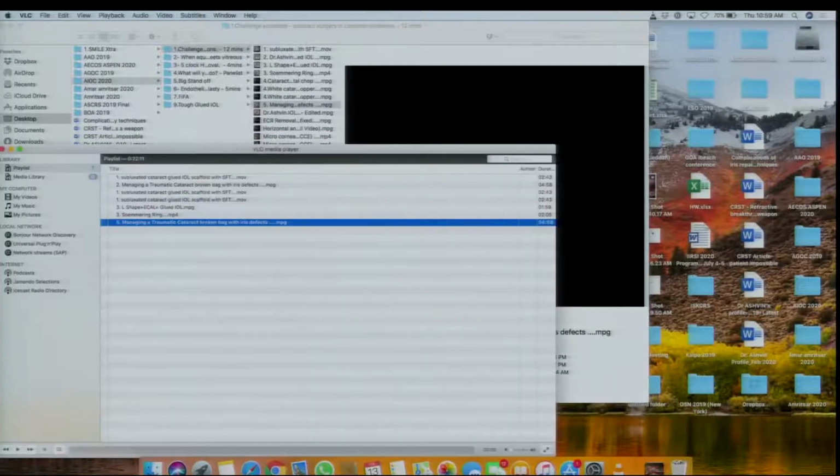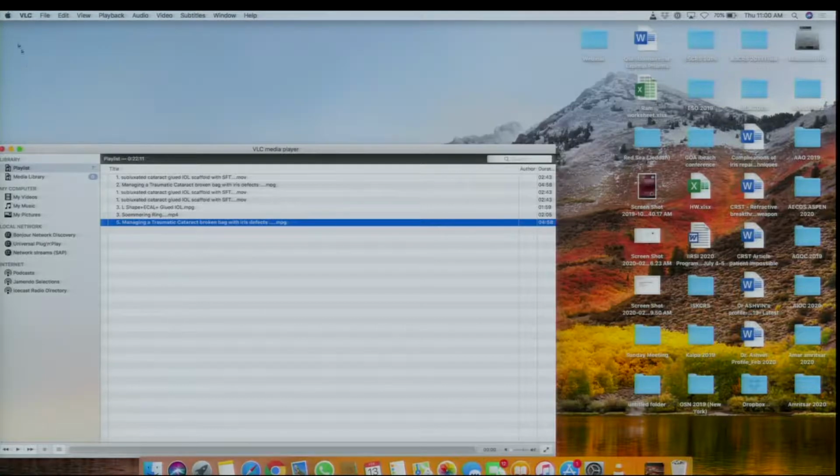The two tricks over here would be to actually do a cautery, which would make it round. If you do a cautery, it pulls the iris away. And that's one method. And the second is doing a vitrectomy. Use a vitrectomy to make that pupil round. These are two tricks which I started to use now and learned from Brandon Ayres from the US.